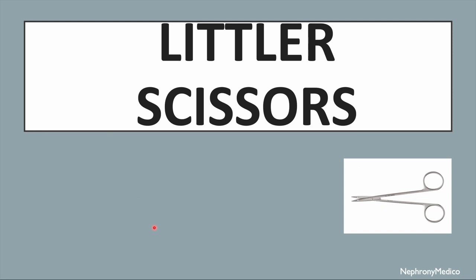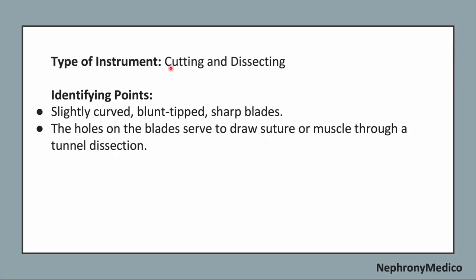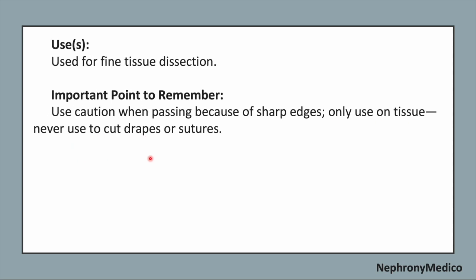Let's talk about Littler scissors. This is a picture showing Littler scissors. It is a cutting and dissecting type of instrument. Now, identifying points. Slightly curved, blunt-tipped and sharp blades. The holes on the blades serve to draw a suture or muscle through a tunnel dissection. Use. It is used for fine tissue dissection. Important point to remember. Use caution when passing because of the sharp edges, and only use on tissue and never use to cut drapes or sutures.